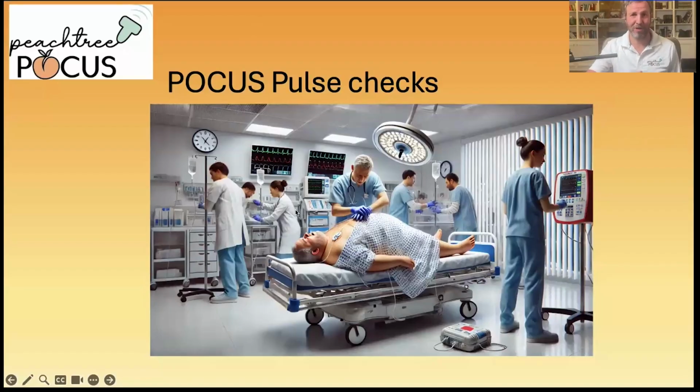So that's where point of care ultrasound can definitely help. Instead of guessing, we can put the probe on the carotid or the femoral artery and directly watch for pulsations.